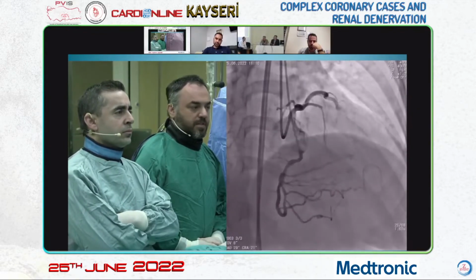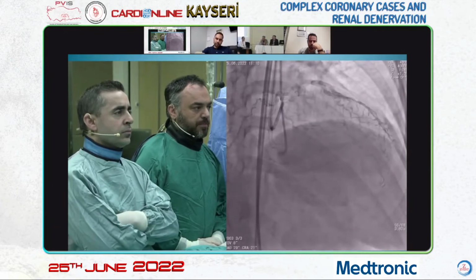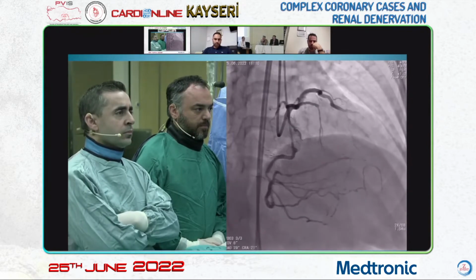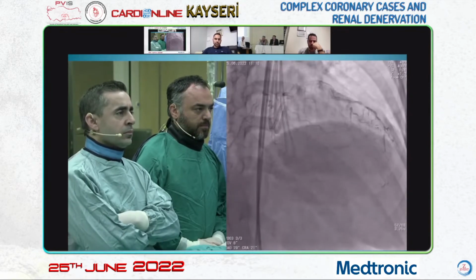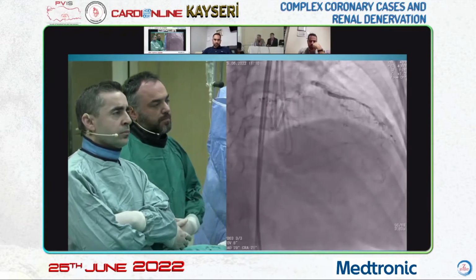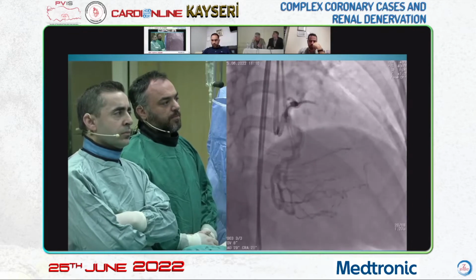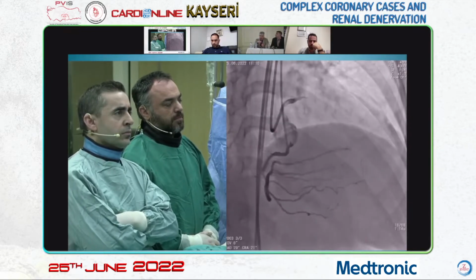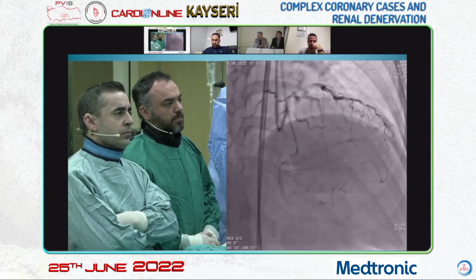However, in the previous images, a subintimal area was closed. Therefore, we lost the channel. Most probably, the wire will go into the subintimal area, as in the previous surgery. IVUS guidance may be used. What would your wire selection be?